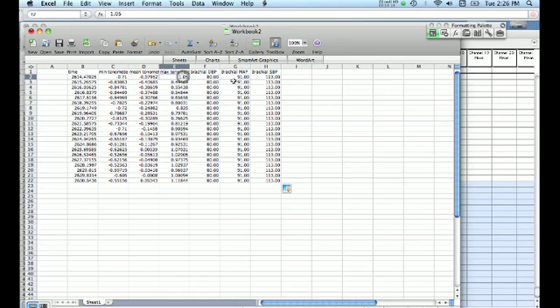So this particular value is not equal to this particular value. So what we need to do is to determine the relationship between these two and these two values and use extrapolation to determine what the systolic blood pressure in the tonometer should be.